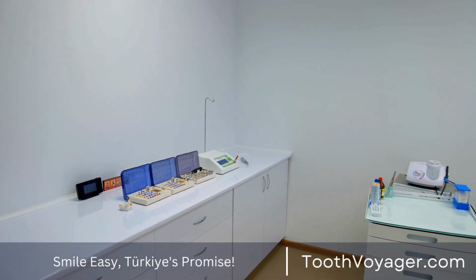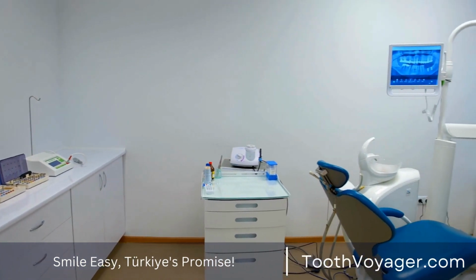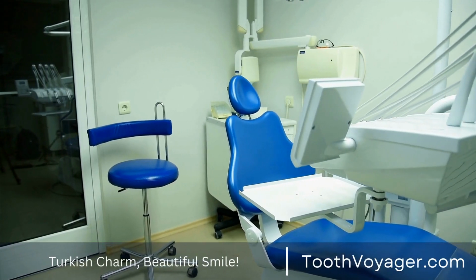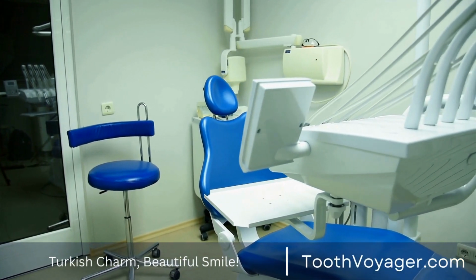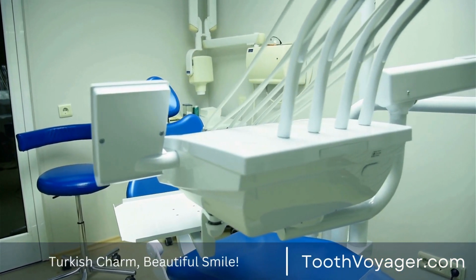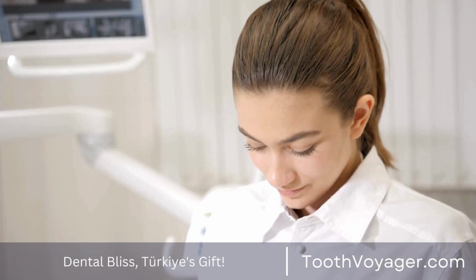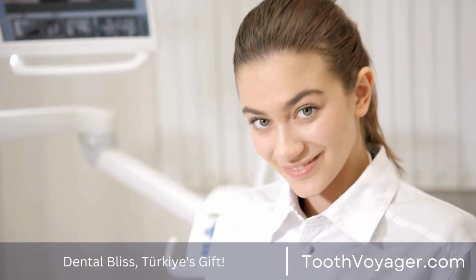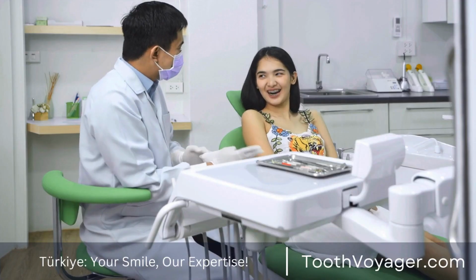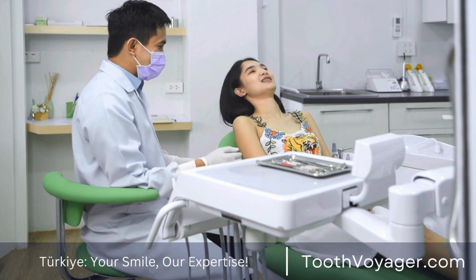Before exploring the art involved in creating custom dental crowns, it's crucial to comprehend what role dental crowns play in restorative dentistry. Dental crowns are used to safeguard and reinforce a tooth that is weak or damaged, to repair damaged or chipped teeth, to cover dental implants, or to enhance the appearance of a distorted or discolored tooth. Dental crowns are generally made from a range of materials, like porcelain, ceramic, and others. Each has distinct advantages, and it is selected depending on the patient's particular desires and requirements.